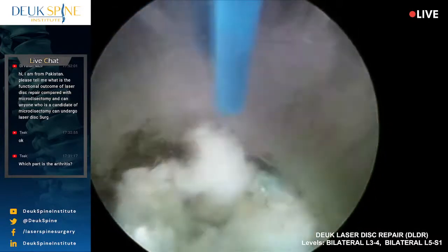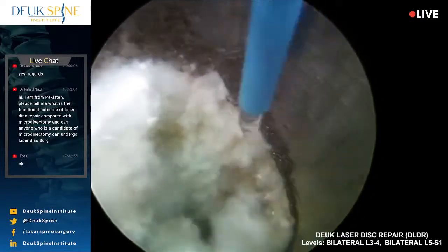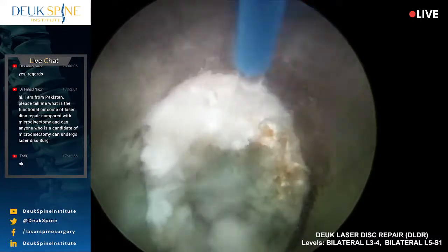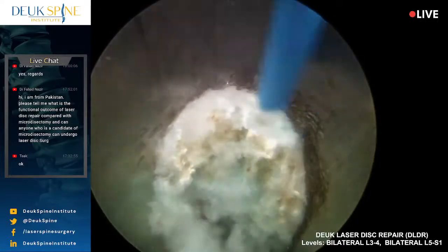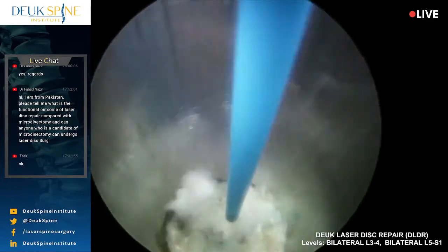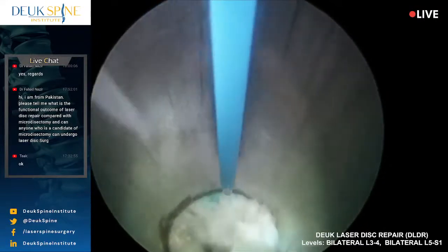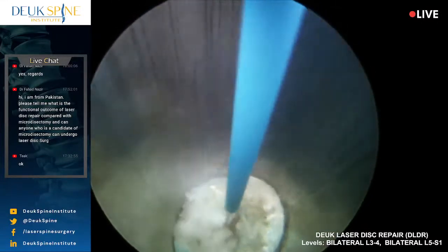How's he doing on propofol intake? Propofol use. Is he sucking it down like a baby drinking milk? Or is he normal? He's using a good bit. More than normal? I'd say so. A lot of these patients metabolize propofol very quickly, with the other drugs they take, pain meds and that kind of thing.